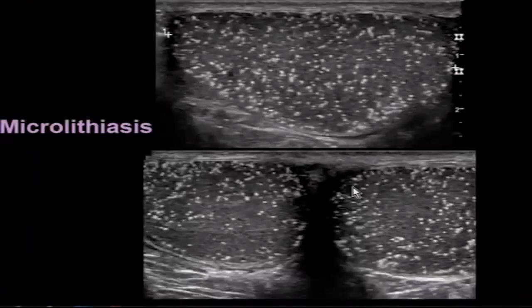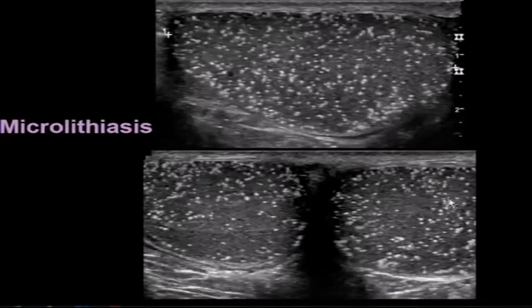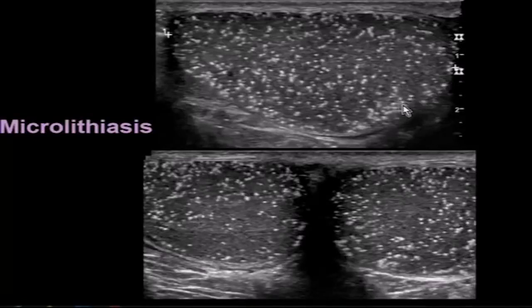Here's a patient with bilateral microlithiasis. On transverse view, both testicles are filled with these tiny bright echoes throughout the parenchyma. On longitudinal view, the entire testicular parenchyma is involved.